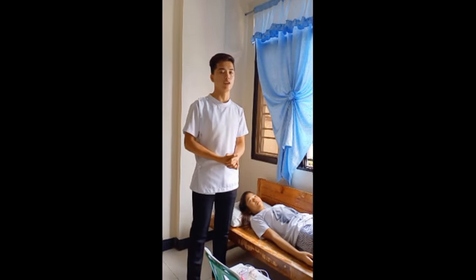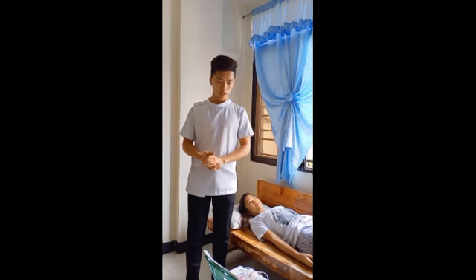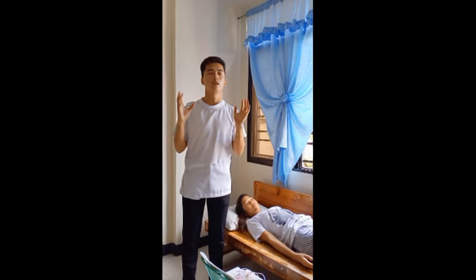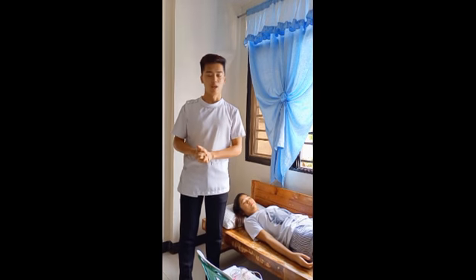So I'm going to verify the doctor's order for my patient and read the condition of the patient. The next is I'm going to prepare all the materials we need. The materials we need are a nasal cannula and a simple face mask. And also we need the flow meter, the tape for the cannula, and also the humidifier cap or humidifier bottle.